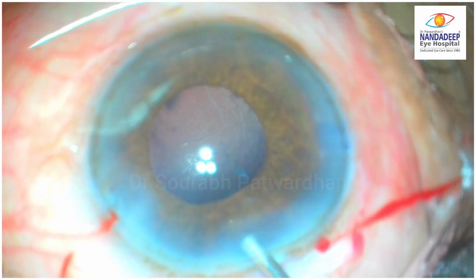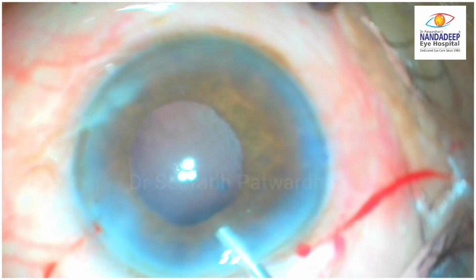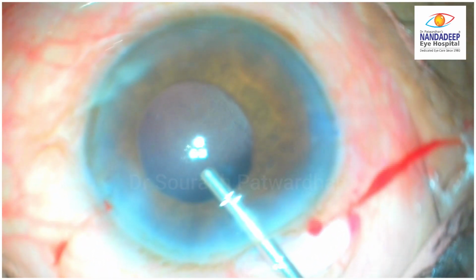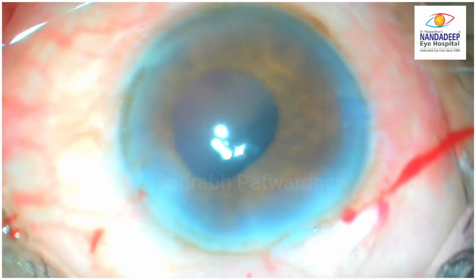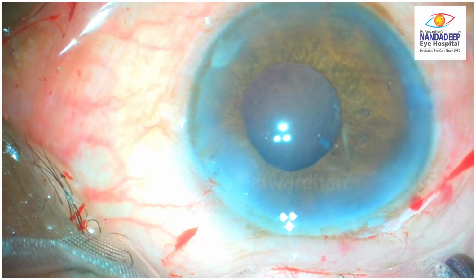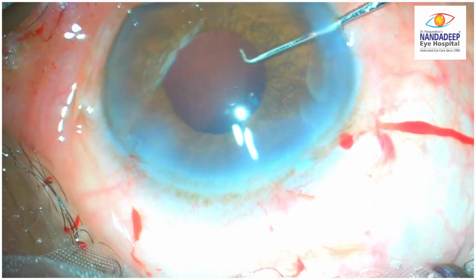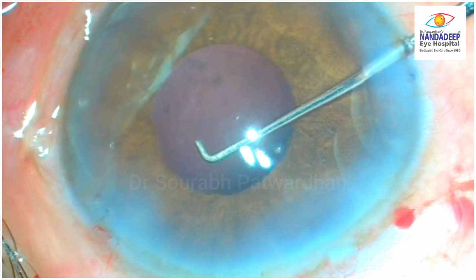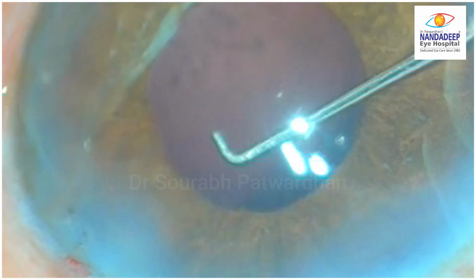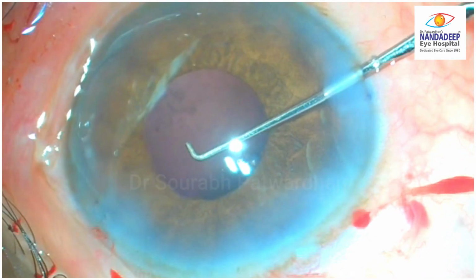So this was just the initial stage of fluid misdirection where the fluid has gone into Berger space and is bulging forward, and as you can see, the surgeon is trying to form the anterior chamber, make it deep for the IOL insertion, but is not able to do that because the PC was bulging forward. Now the surgeon had doubt whether it is the PC still there or it's vitreous which is bulging forward, so went with a blunt Sinskey, and you can watch that as the surgeon touches the PC, you can see the reflex around it which indicates that the posterior capsule is intact. Many people fear to do this, but with a blunt instrument it is absolutely safe to check for the posterior capsule.